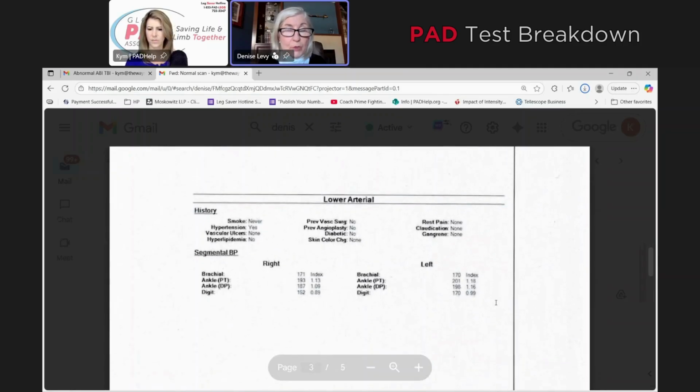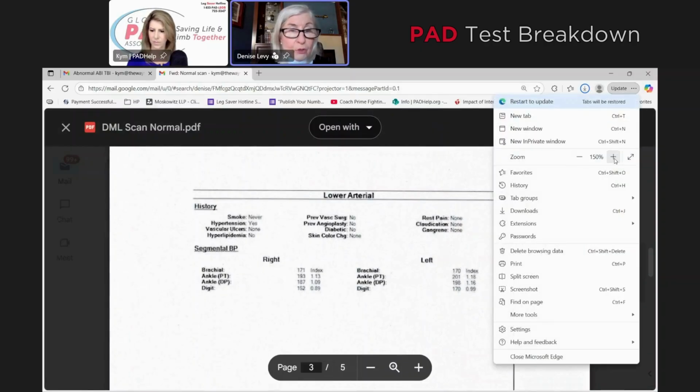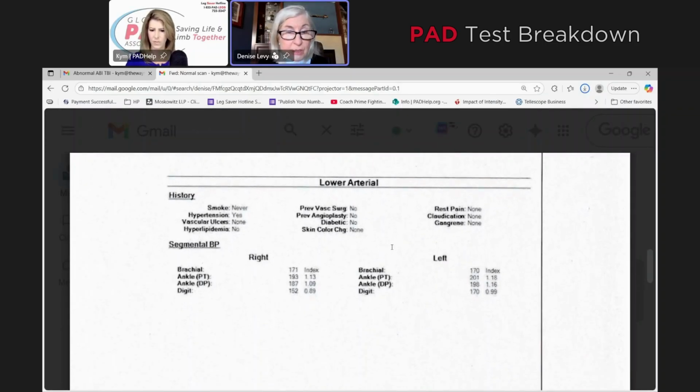Now, this is what we take history on. So, smoker, no. Hypertension, yes. We go through all of these questions on every patient so that we can get a good history. You can go down further.